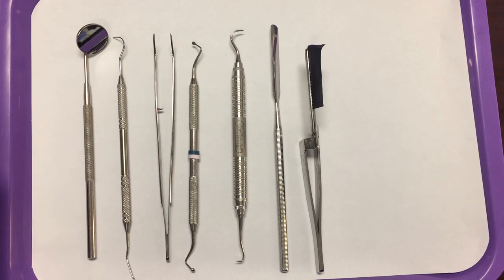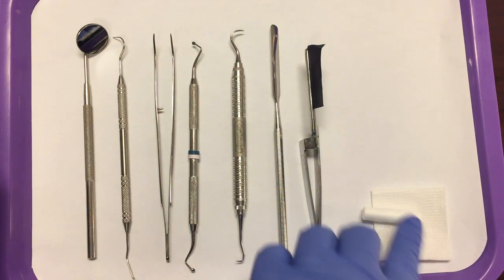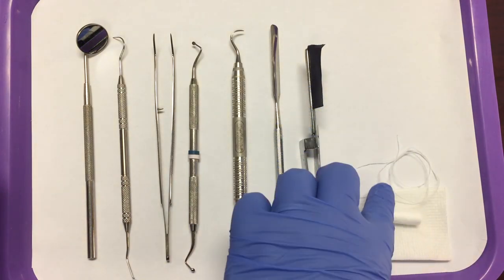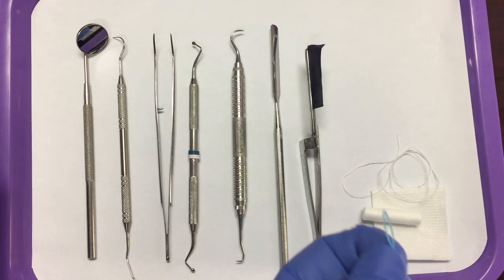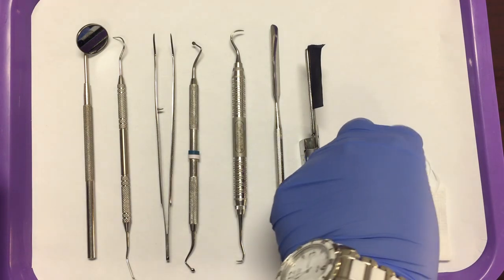For your accessories, you will need your gauze and cotton rolls to help control moisture and to help isolate the teeth. You will need your floss to check the contact areas of the restoration. If it's a bridge, you will also need your floss threader to help get the floss underneath the pontic.